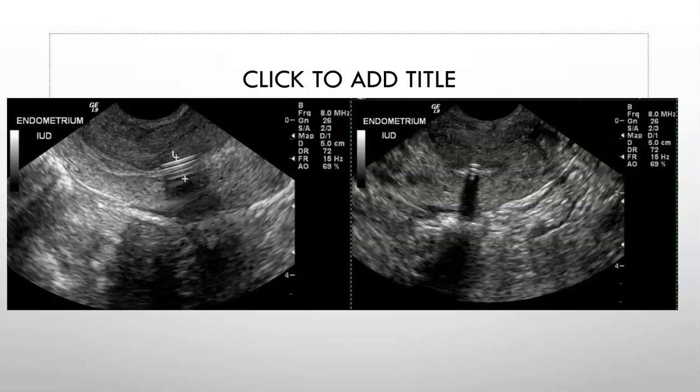Here is one that was found in the wild. This is a particular type of speed error artifact that occurred. One of my colleagues was scanning this uterus, and she said that the IUD that was present, and we can see the IUD, she said it was not in the endometrium because you can see the reflection of the IUD in front of the endometrium. This is in the myometrium. We're starting to see that reflection. So she said it was a misplaced IUD.